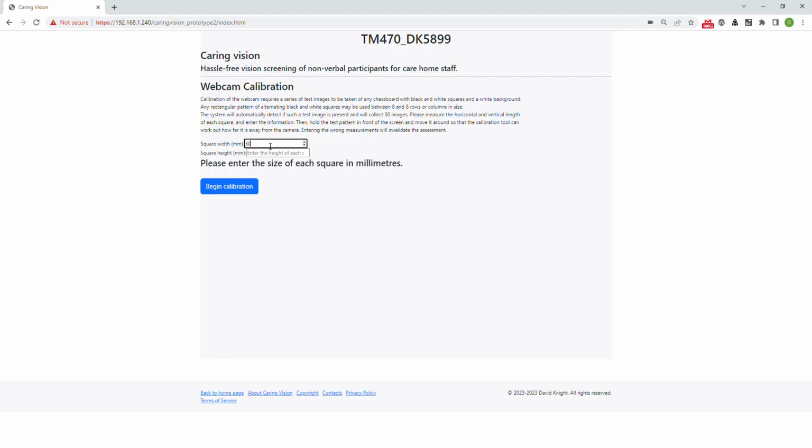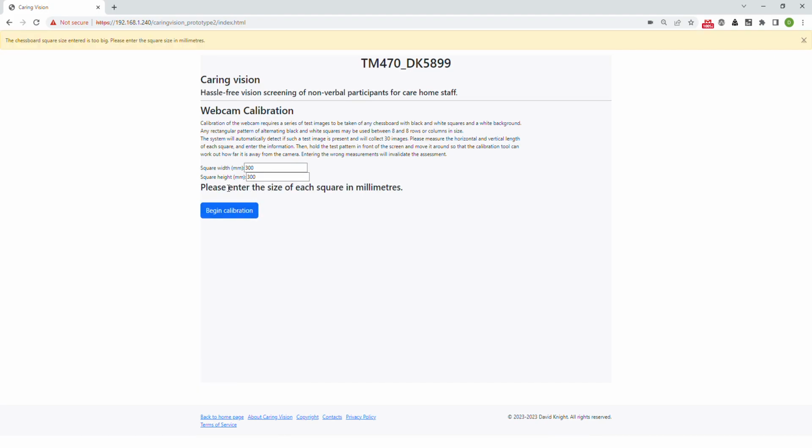If I make a mistake and I accidentally put 300 in, let's see what happens. Begin the calibration, and it straight away tells me that the square size is too big. Of course, it's quite right, so we're going to change that to 30. And indeed, there are plenty of checks like that as we go through, and we'll encounter a few of them as we go along.